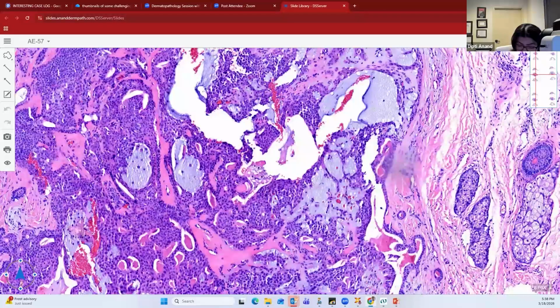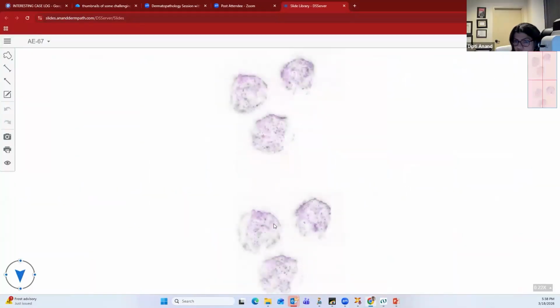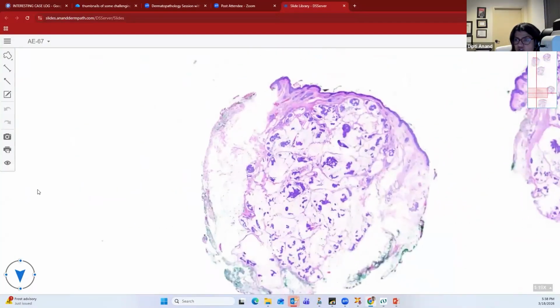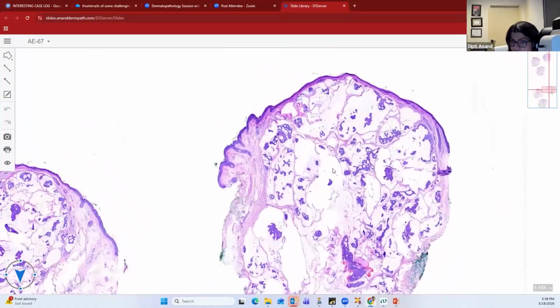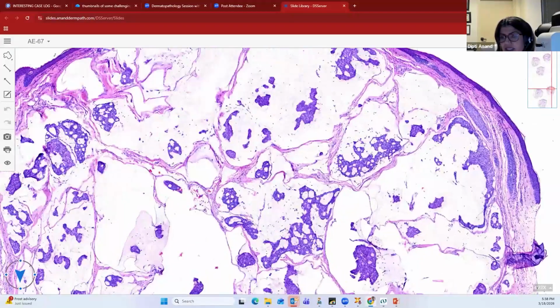The two malignant tumors that I want to talk about, which can be tested, number one is your primary mucinous colloid carcinoma. This tumor classically occurs in the eyelid region. It has a beautiful morphology. It will always look like this. It is multilobular. So you can see these nice, delicate fibrous septae separating the tumor islands.